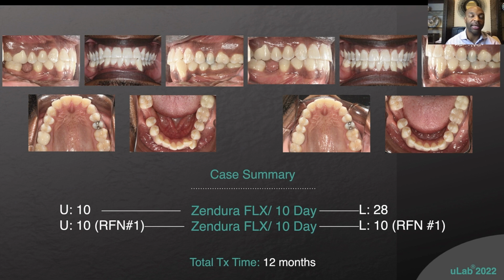And so again, when you look at the efficiency, it's hard to beat with aligners because you just let them work. And I think we saw him maybe 5 times throughout the whole year of treatment. And to get the results that we got, I was extremely thrilled about it.